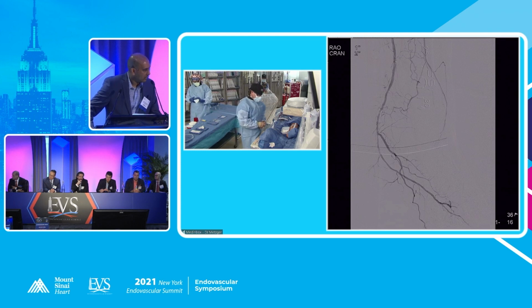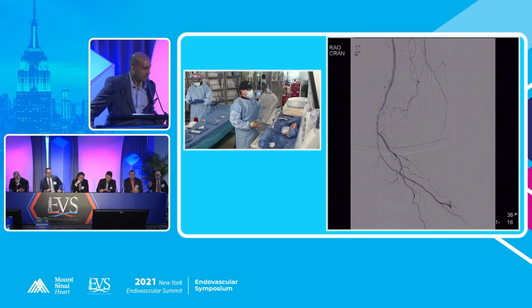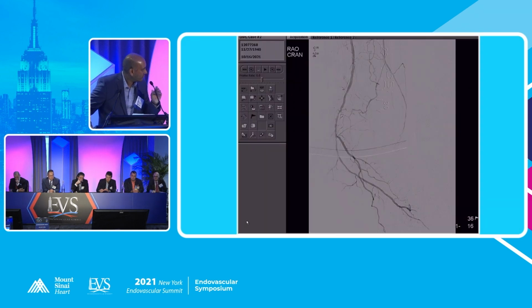What do you think? Let's start with Eric at the end, and maybe we could add another question. Would anybody touch that distal PT common plantar artery at this point? It's a little bit narrowed, but again, we were willing to stop after the common femoral artery. So do we really need to touch it? So 2 questions. What do you think, Eric? Yeah, fantastic result. Congratulations. I think you're definitely done. Nothing else to treat here.